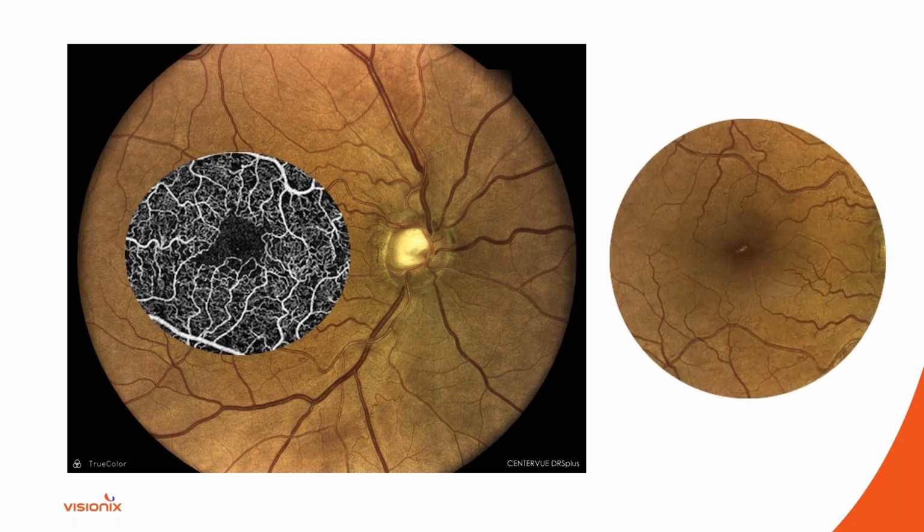And there I blew up the macular area just to show you that from the clinical standpoint, there's really nothing there. Okay, so this is something that all of us would miss without getting this angiogram. This, once again, would be a patient that you would say, you know what, don't worry about it.